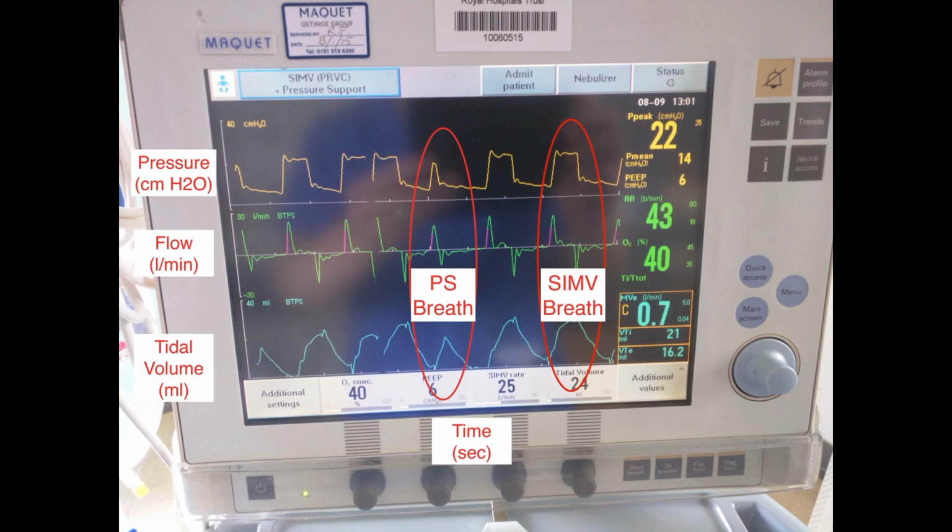And you can see a nice difference. I've highlighted the two breaths on the graph there. You can see the big SIMV PRVC breaths that have a guaranteed I time and a bigger tidal volume, whereas you look at the pressure support breaths, there's no guaranteed I time, they're much shorter, and also they generate a much lower tidal volume as well. So these are the support breaths.